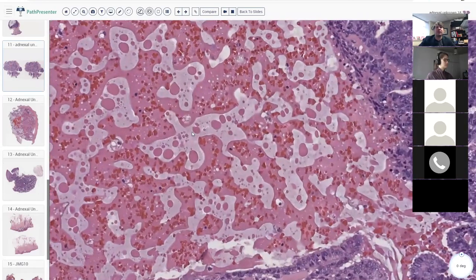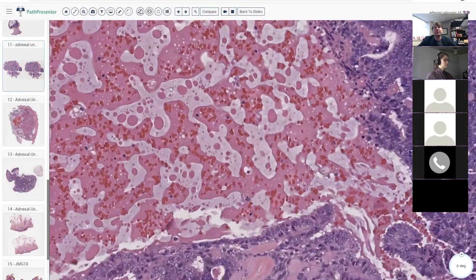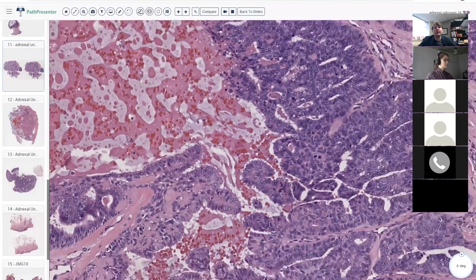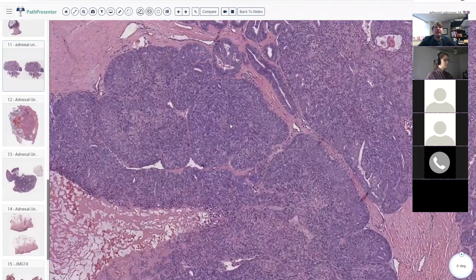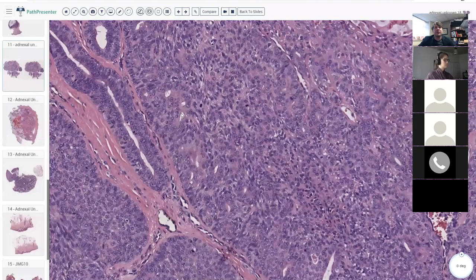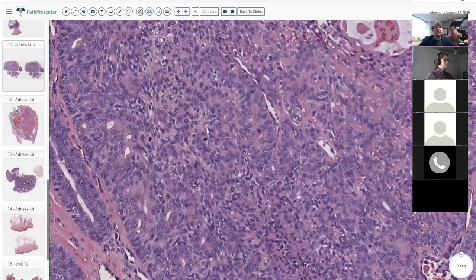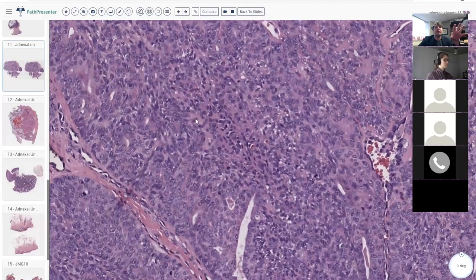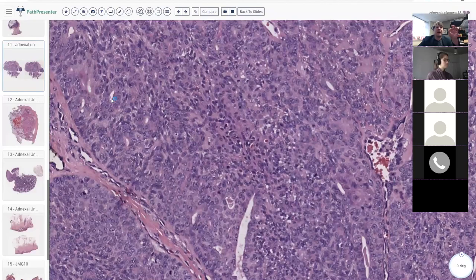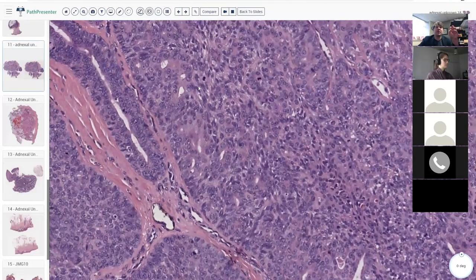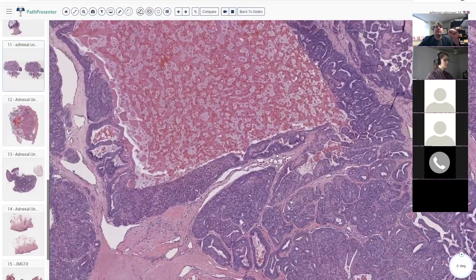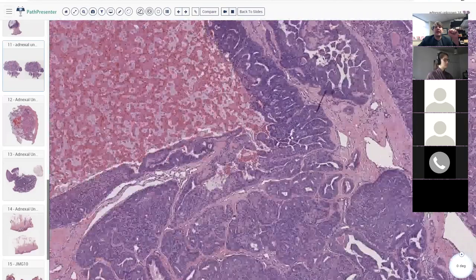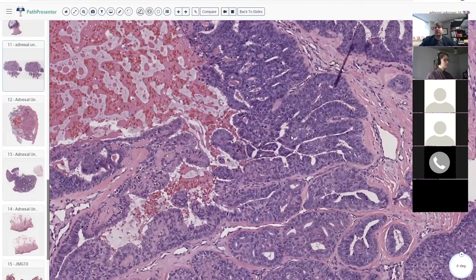This is quite beautiful — look at the secretion, it's all like a lava lamp, really pretty. In other areas it's quite solid with little tubules. We've got solid nodules of relatively uniform epithelial cells, maybe a few mitoses but pretty uniform, not really ugly, punctuated by tubules and ducts. And then we've got dilated cystic spaces that have papillae and/or micropapillae protruding into the lumen.